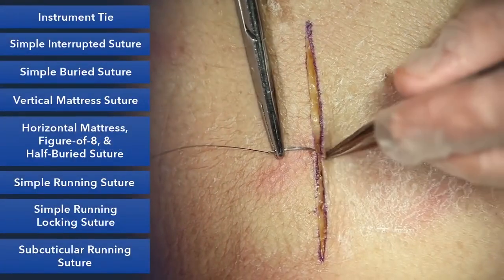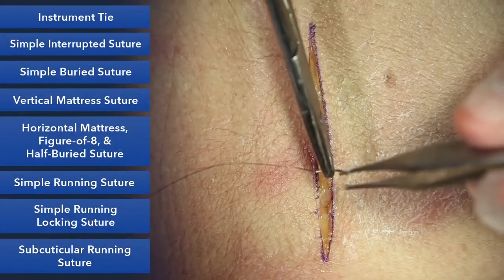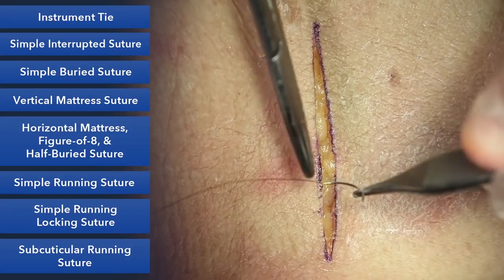The first suture we're going to teach you is the simple interrupted suture. This is the most common suture that you'll be using in wound closure.